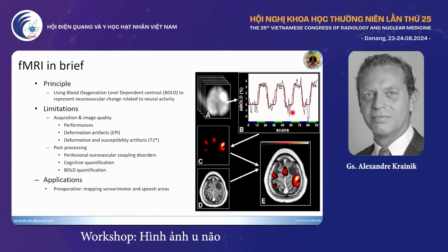And then you can measure for each voxel, here is a black dotted line for this voxel, the temporal course of the signal change along with this activation paradigm. Rest, activation, or right, and movement, rest, activation, and so on. And then, considering this paradigm, you may infer that you have a signal change symbolized by the red line here.